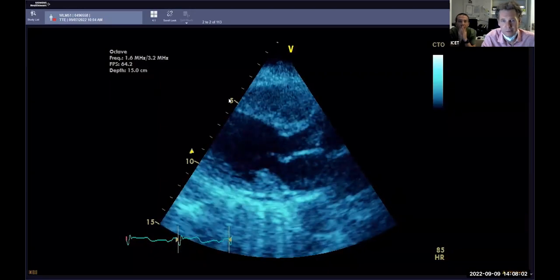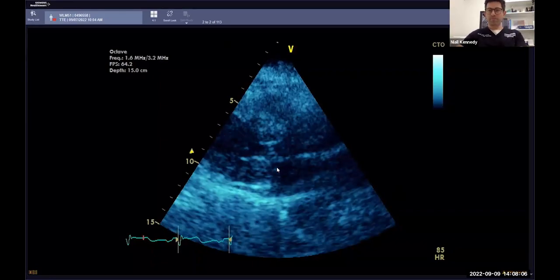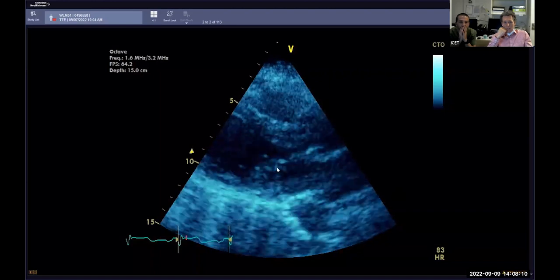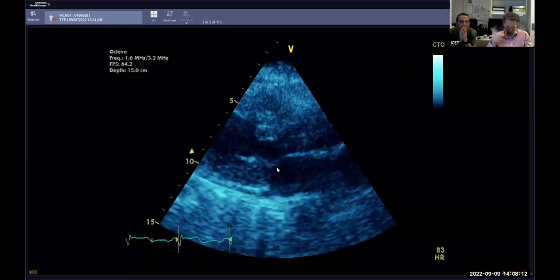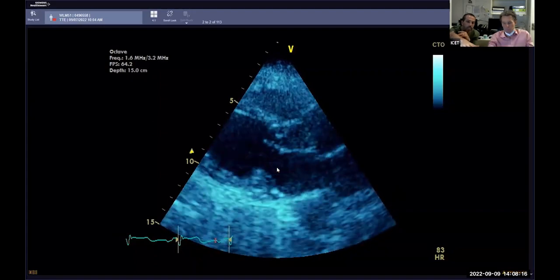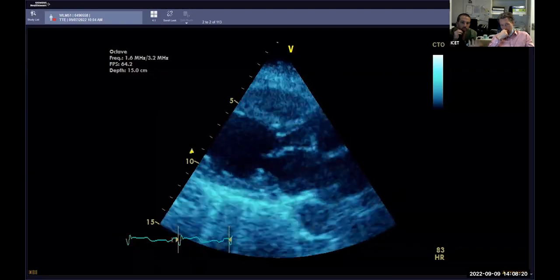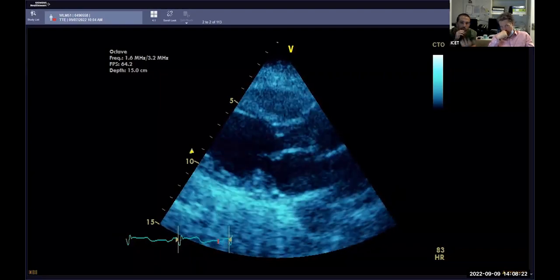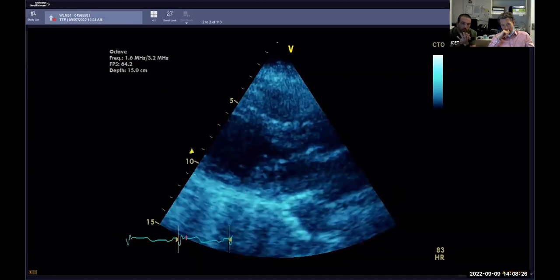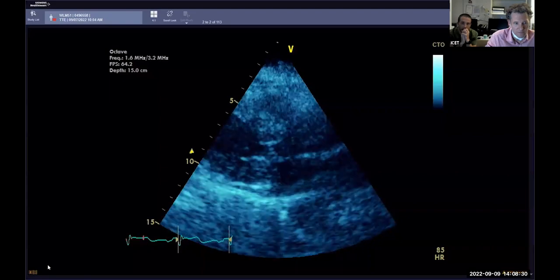So, a 70-year-old lady with an abnormal ECG, query ischemia, regional wall motion abnormalities, and troponins in the 4,500s. Additionally, there are a lot of B lines coming off that posterior region, suggesting a component of acute cardiac impairment or interstitial water. Regarding the rest of the study, the left atrium is probably of normal size. The right ventricular outflow tract is probably of normal size. The aorta looks okay. The aortic valve looks okay.